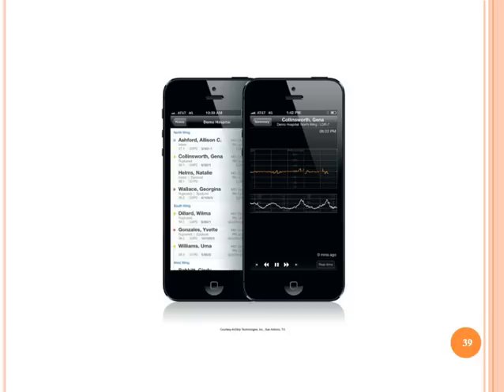This is figure 15-20 in your textbook. It's a way that providers can access near real-time fetal heart rate tracings and review patient data using their mobile phones. And like I said in class, they also have it where they can log in from a remote location, such as their office or their home, and they can actually see what's going on with the patient, document on the tracing, order things that the patient may need.